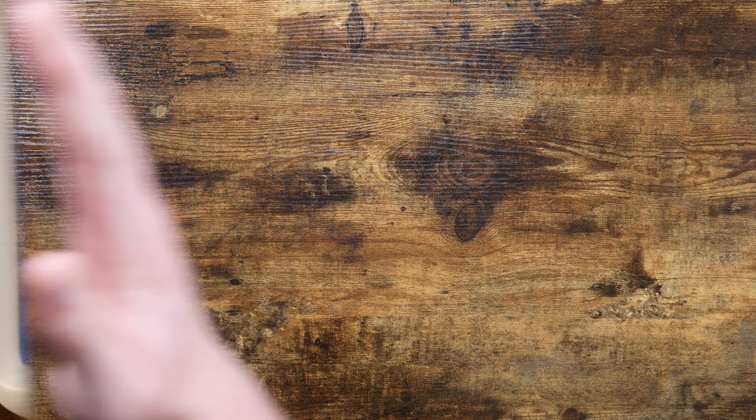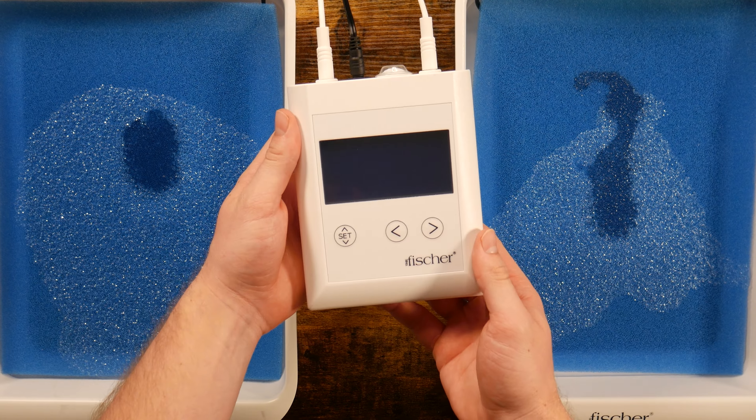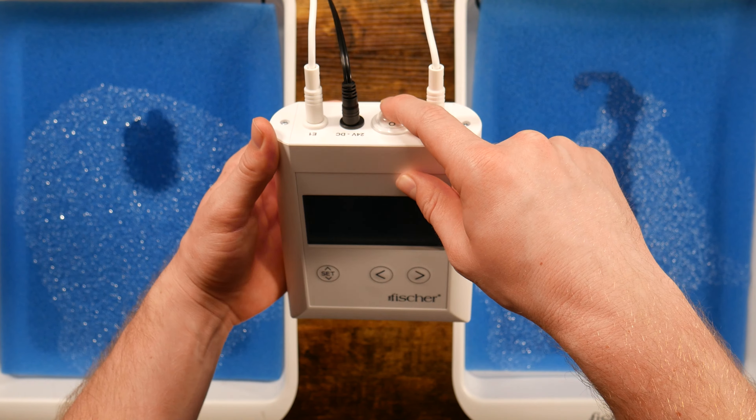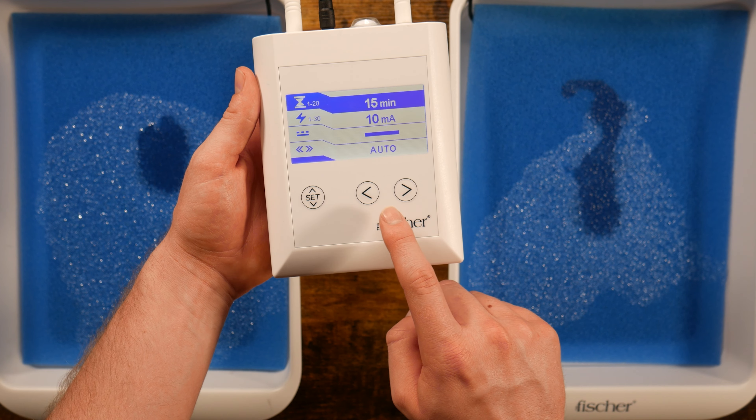Today, we're going to guide you through the different settings on your Fischer device. Once your device is set up and ready to use, go ahead and turn on the device. You can find the power button on the back. This three-button interface will make your treatments simple and easy.